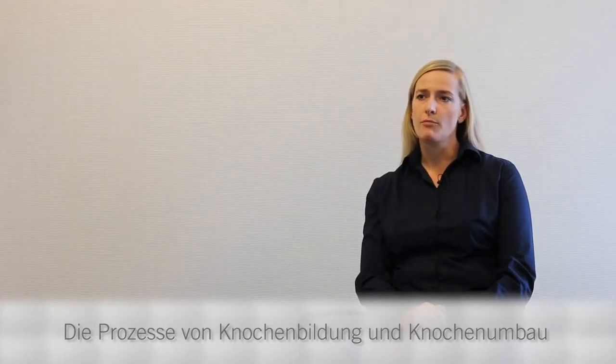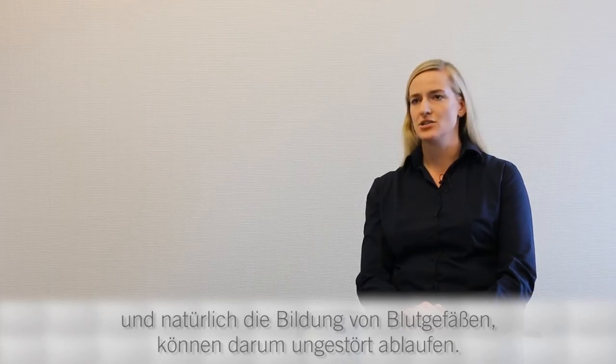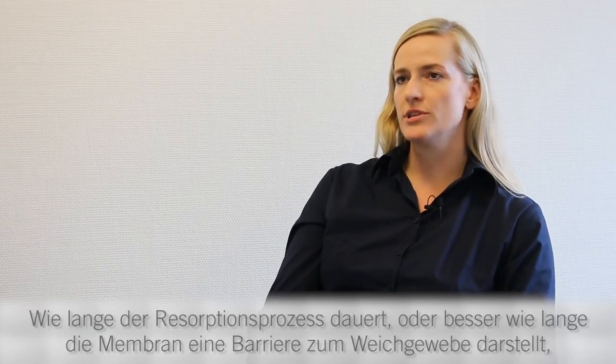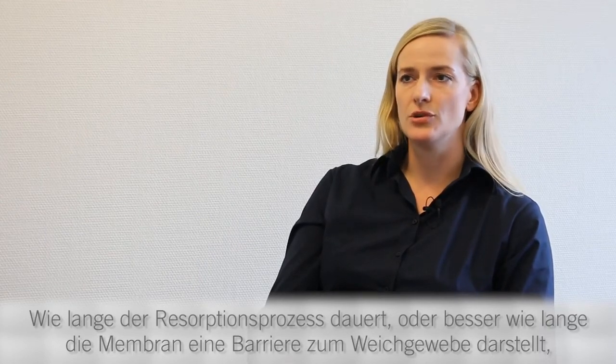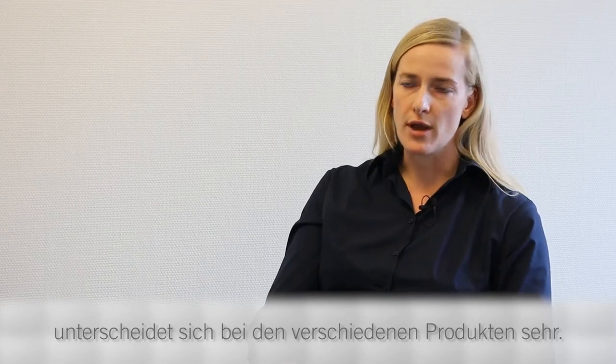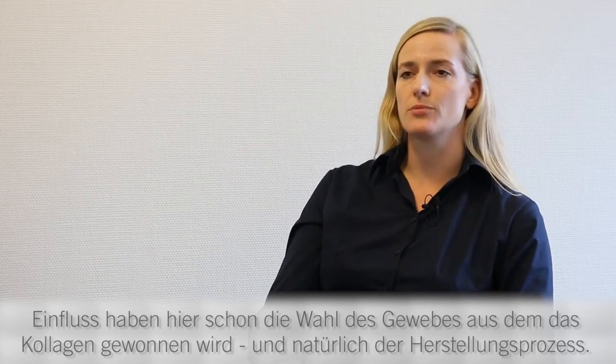The processes of bone formation and reorganization, and of course the formation of blood vessels, can therefore proceed undisturbed. For our understanding, the use of bone substitute materials is always associated with the use of a barrier membrane. Barrier membranes made of collagen are resorbable. How long the resorption process takes, or rather how long the membrane acts as a barrier to the soft tissue, varies greatly between different products. The tissue from which the collagen is obtained, as well as the production process, influences the resorption process.